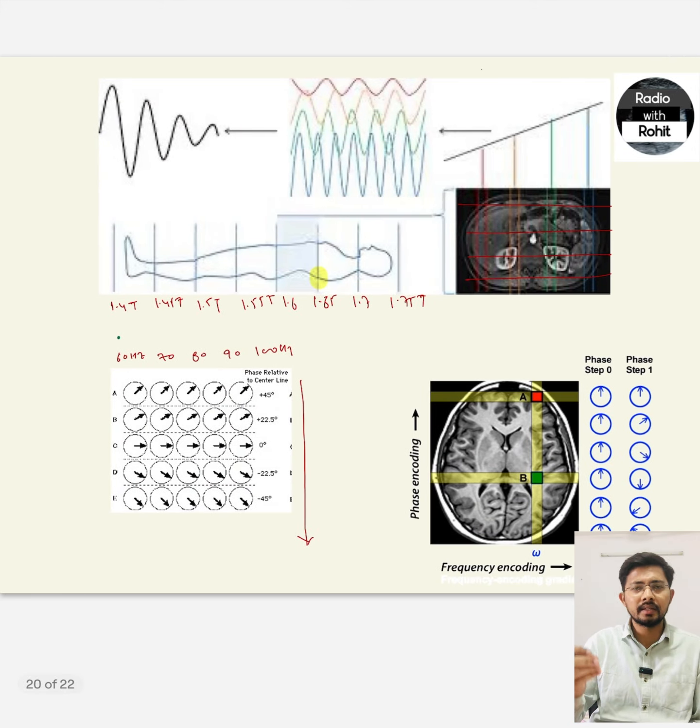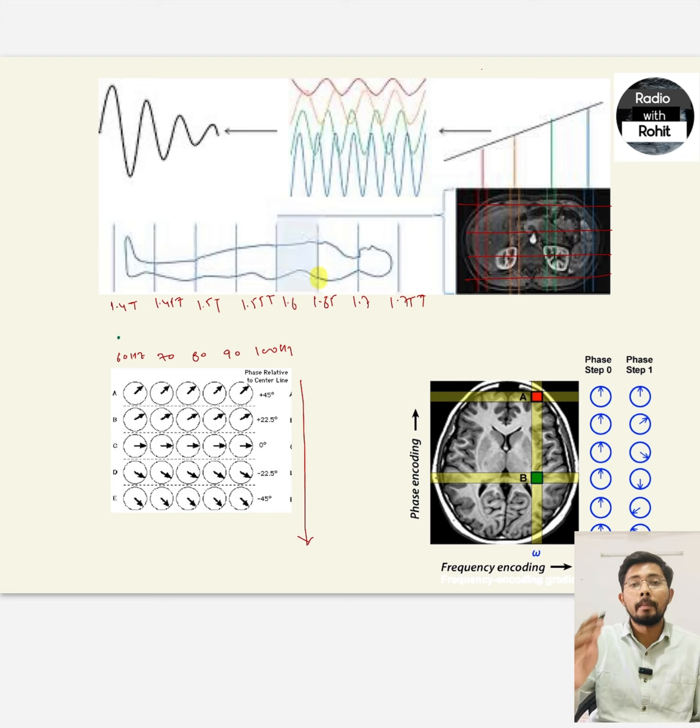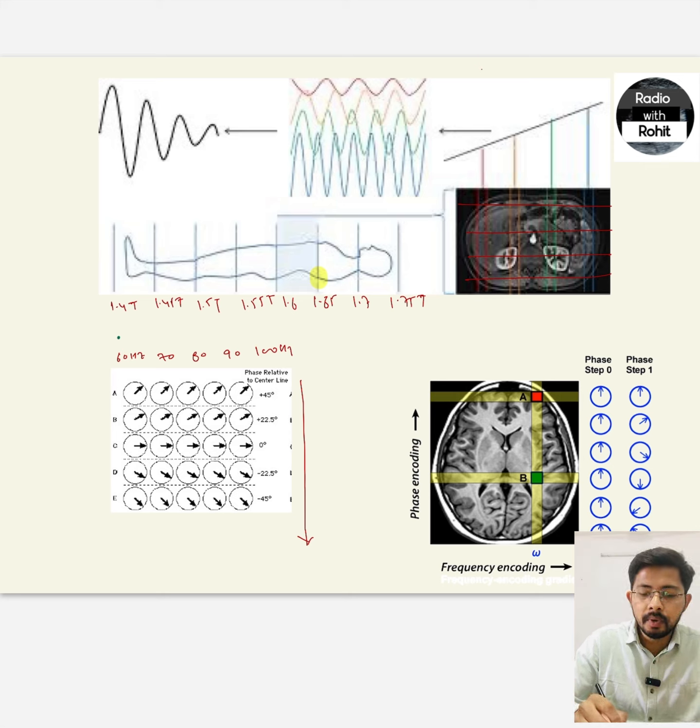We will understand it. This is a very simple topic. Just imagine that you want to scan the abdominal part of this patient. So we have to make a fixed number of slices through this patient. For that, we will apply a gradient of the MRI machine.